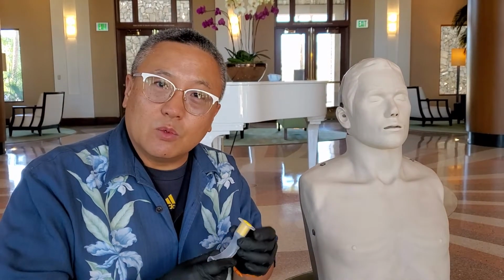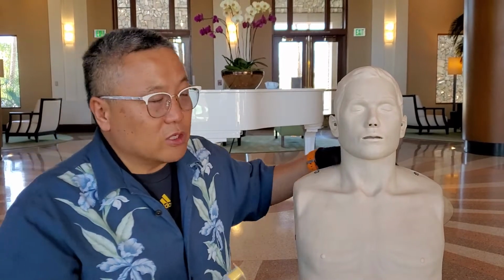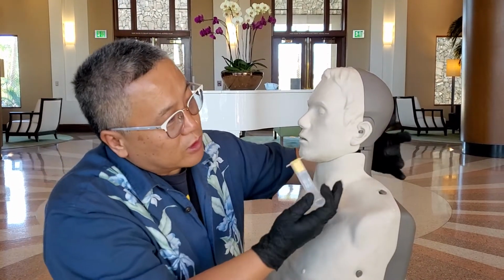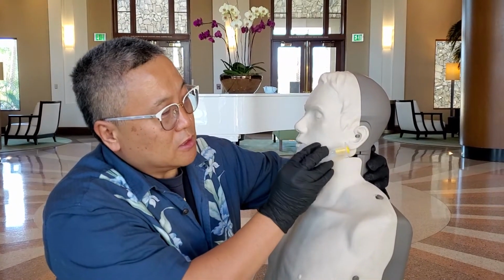Okay, so when we give them an OPA, the patient has to be unconscious. Why? Because if the patient has a gag reflex, you get in big trouble. So you have to use the suction. Okay? So I will show you how to measure. For the OPA, measure from the earlobe to the edge of the mouth, like this.